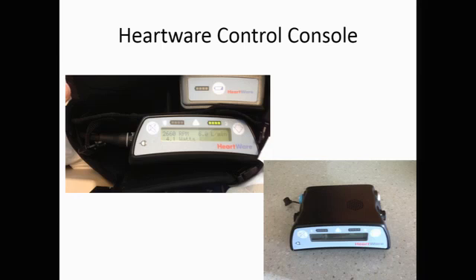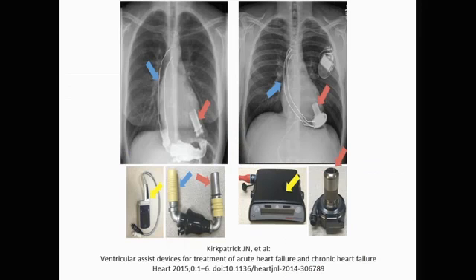Once again, it's got an LCD screen that kind of goes light and dark. I put this slide in as a cut and paste from a journal article from just last year. The problem I have with it is that the people who published the journal screwed up the aspect ratios on all of these X-rays. So all these images are taller and narrower than they should be.